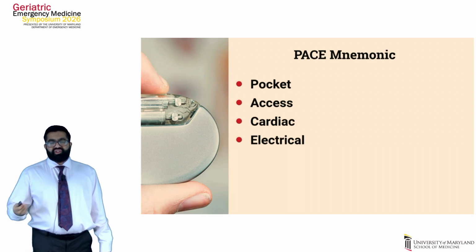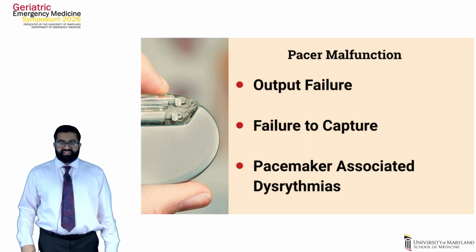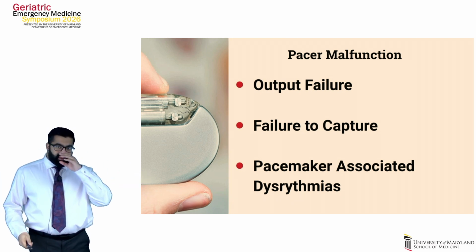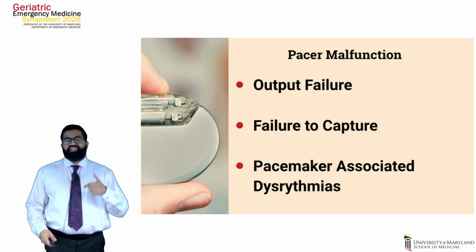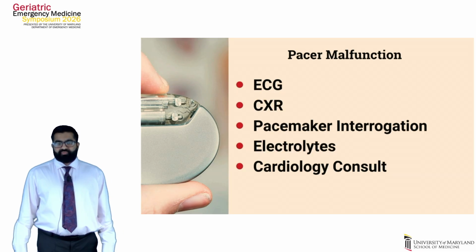Now, on to our last part of the mnemonic, our electrical complications, or what I like to just broadly call pacer malfunction. There's 3 buckets that I think of: output failure, failure to capture, and pacemaker-associated dysrhythmias.